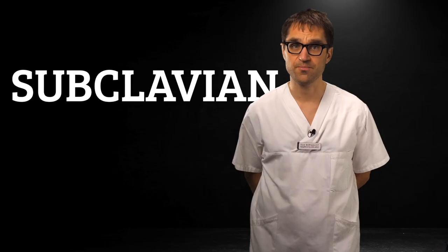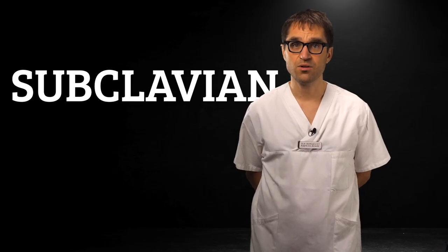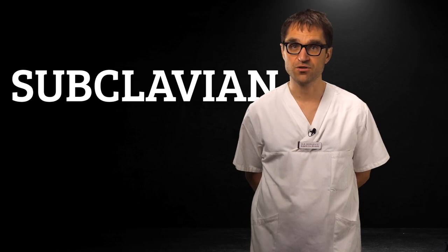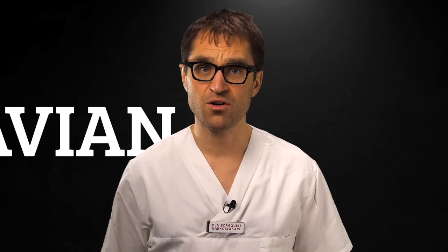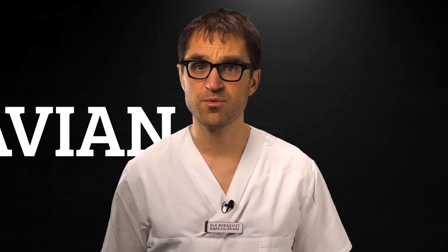Now the next point is a bit controversial, but we believe your central lines should be subclavian. This is the goal and ambition. It will require a lot of practice and we're going to show you how. We recommend you learn it under expert supervision and that you first become an expert on IJ cannulation. However, the subclavian is always our first-hand choice for a couple of reasons.